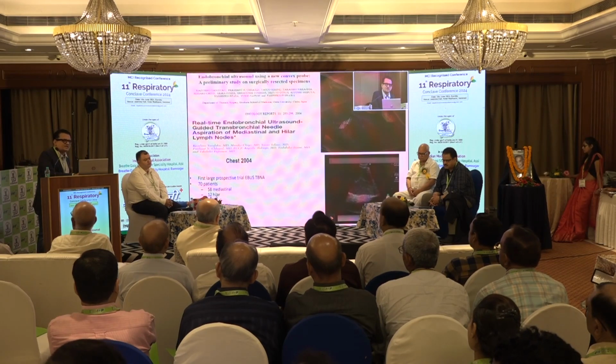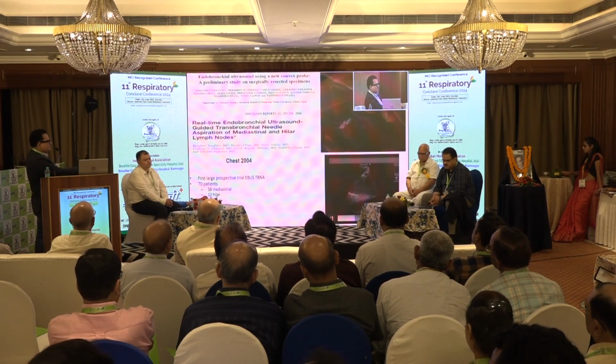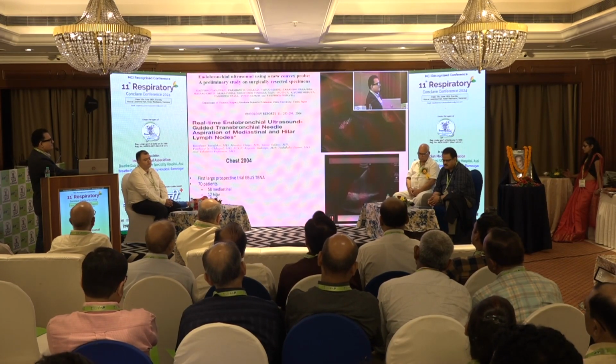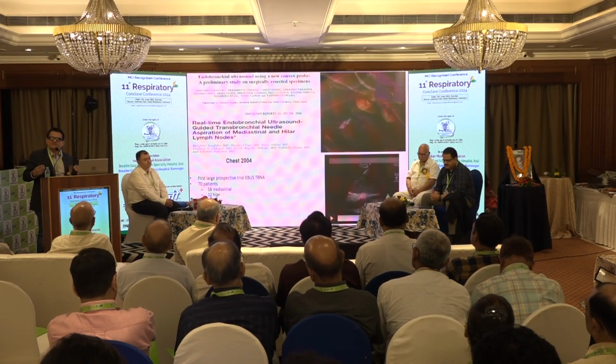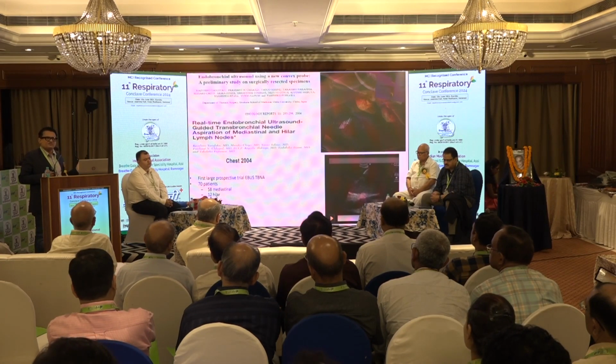And in this particular case, what do you see here? You can see the needle going here. Look at the second image here. You can see the needle going into the lymph node here. There's a pulsating blood vessel here. And under image guidance, you can be sure where you have gone in and where the biopsy is taken from. So this is the research we did. Now, we are celebrating 20 years of EBUS since we published the first paper. And it is very good to see that the first paper which we published is now standard of care.